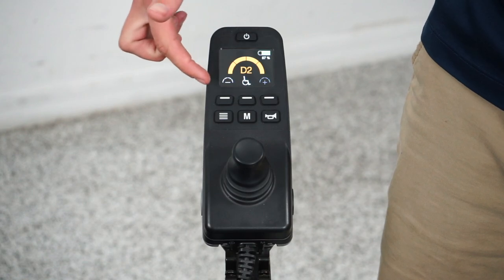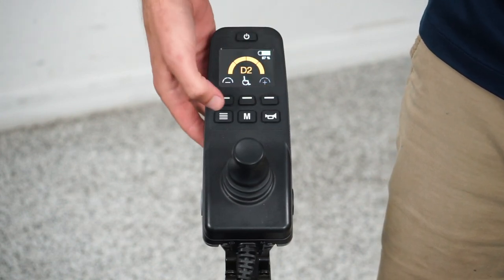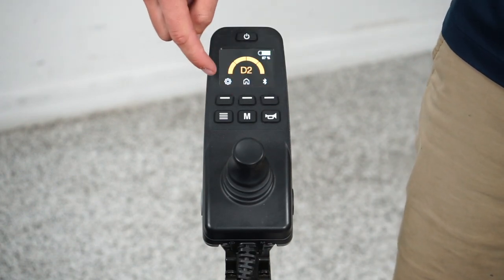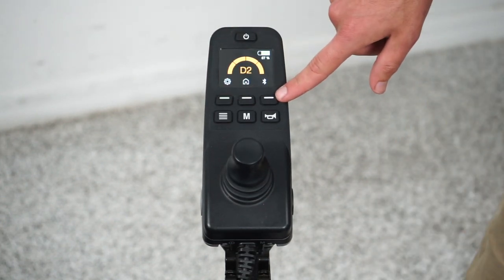The button with four lines changes what those three buttons do. If I press that, instead of increasing the speed or going to the function menu, I can now go to the setting menu with one button, go to a home screen with another button, or go to the Bluetooth screen with the third button.